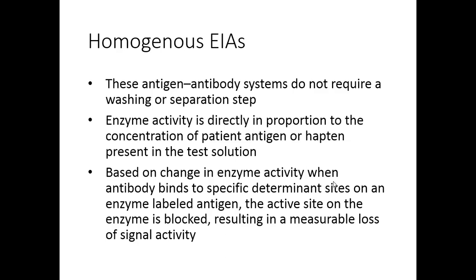antigen meets labeled antibody and something happens, right? A color change, some kind of signal change. That's the most basic reaction that could take place. We've seen variants of it, but the most basic is, boy meets girl, color changes, we're done. So antibody meets labeled antigen, or no, antigen meets labeled antibody. I guess it could be either way. And a color change happens.